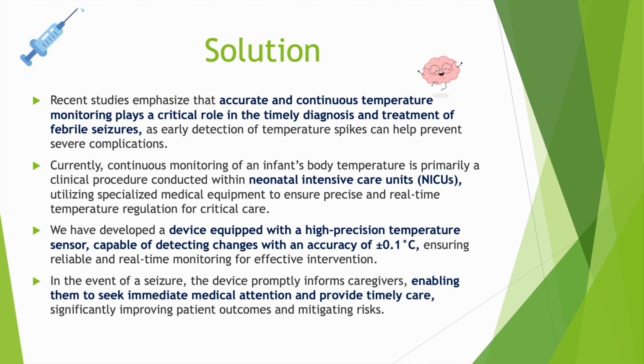is known in neonatal intensive care units, utilizing specialized medical equipment to ensure precise and real-time temperature regulation for critical care. We have developed a device equipped with a high precision temperature sensor capable of detecting changes with an accuracy of plus minus 0.1 degree centigrade, ensuring reliable and real time monitoring for effective intervention.